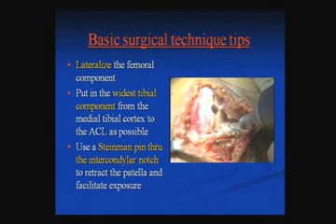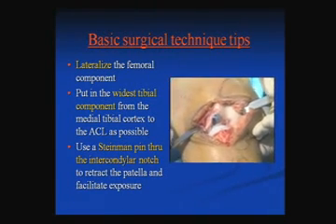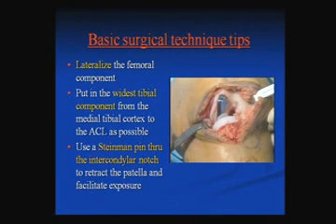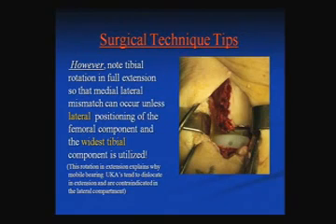And this is an old Marmor I put in about 10 years ago just to kind of show you these are pretty simplistic, easy to do through a small incision. And that series actually did pretty well with the original Marmors. You need to lateralize the femoral component because in flexion, excellent alignment is apparent with the widest tibial component from the medial tibial cortex to the ACL as possible.